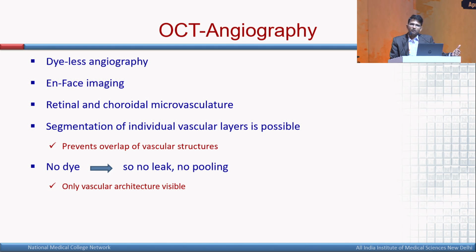Another important benefit of OCT angiography is that it doesn't require any dye, doesn't have any side effects, can be done very quickly, and can be repeated in patients who require repeated imaging, unlike fluorescein angiography, which can have side effects and contraindications and is not routinely done on successive follow-ups.